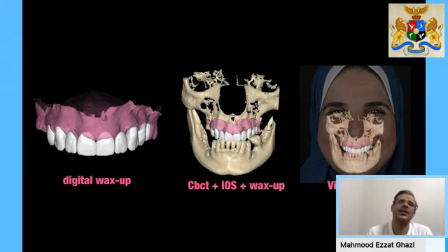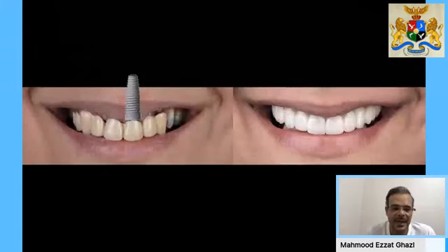And then I started to think even a step further, or a little differently, because each case differs from the other, meaning that placing an implant would differ according to the type of prosthesis that you'll be able to deliver for this patient. Is it going to be an FP1 prosthesis, meaning that the implant should be placed in exactly the same position where the root should be, as in this case, let's say?